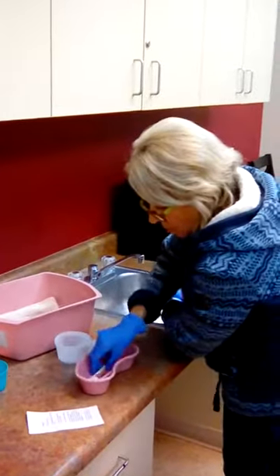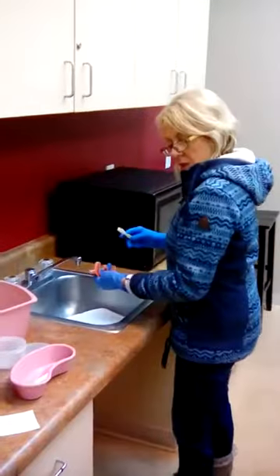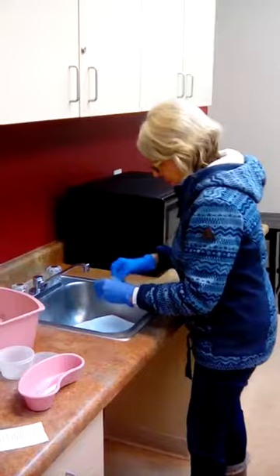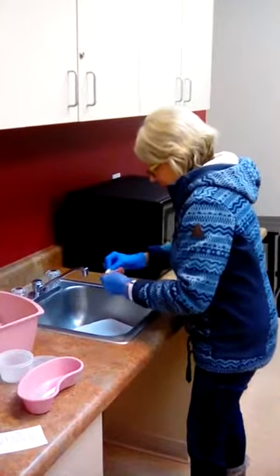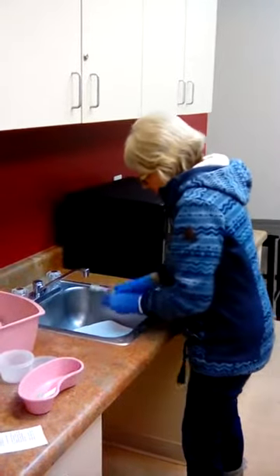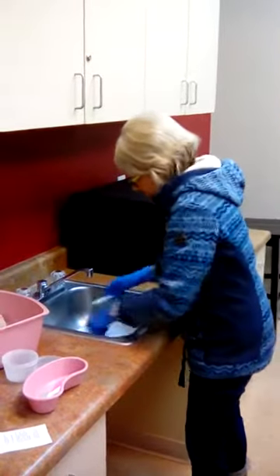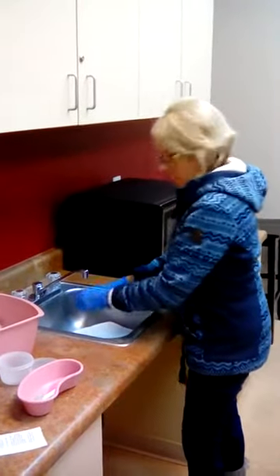Get a toothbrush — I like this toothbrush — and we're going to brush them. Brush them to get all the dirt out, and then make sure to rinse them.